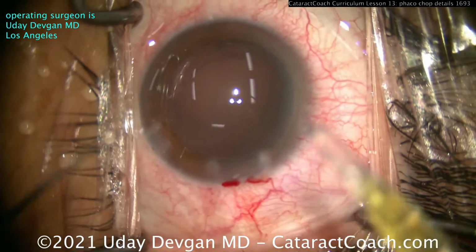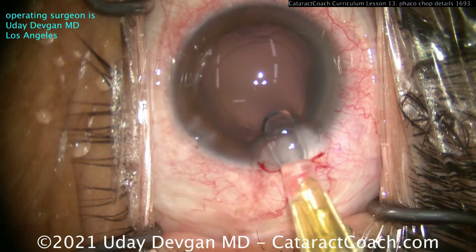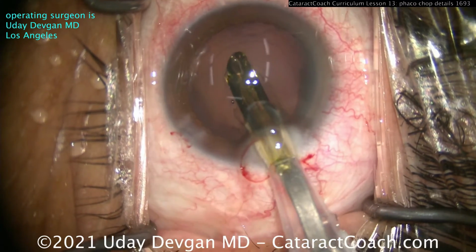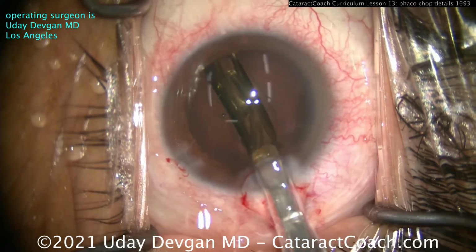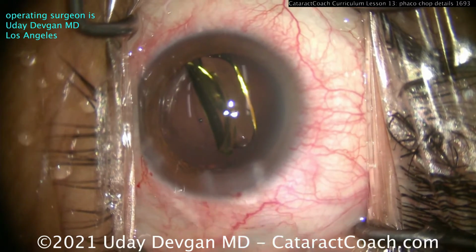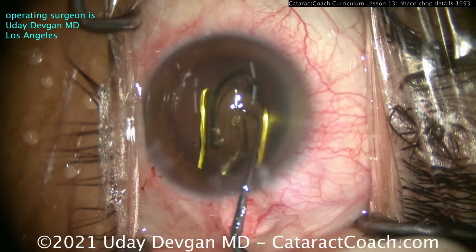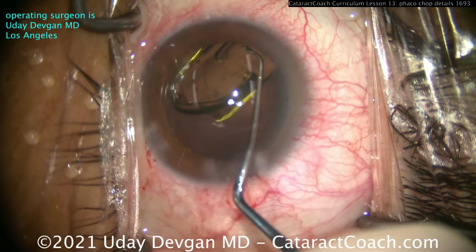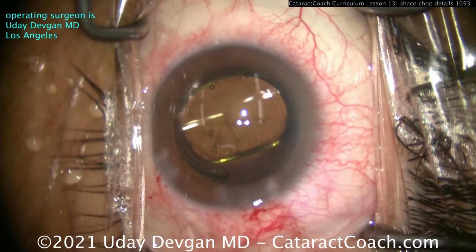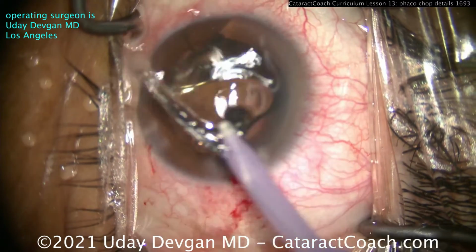And again, for those keeping score at home, how's that draping doing? Draping is looking pretty good. And you need to have the same thing. You've got to hold yourself to a higher standard. Don't submit me a video with eyelashes everywhere and gooey gunk on the Tegaderm film. Start with the basics. Fix that first. All right, here's the lens in the capsular bag. Let's rotate it a little bit, get those haptics open. Beautiful looking case.